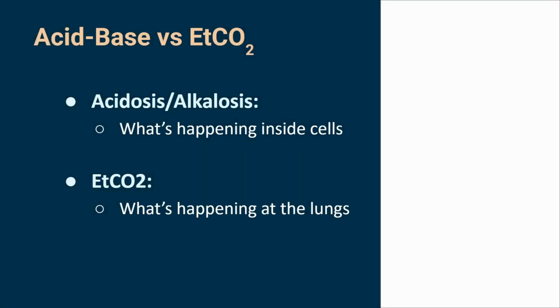Why would a person in cardiac arrest have low end tidal? No ventilation. Rose? Is it in the wrong place? That's a great answer. I love that. I wish I'd have thought of that. Yeah, sure. Maybe you've attached it to his rear end. Yeah, sure. It's gonna monitor methane from that point.